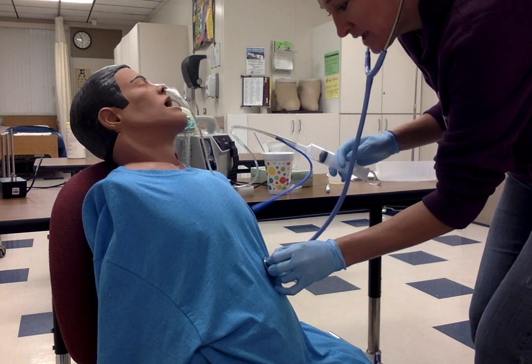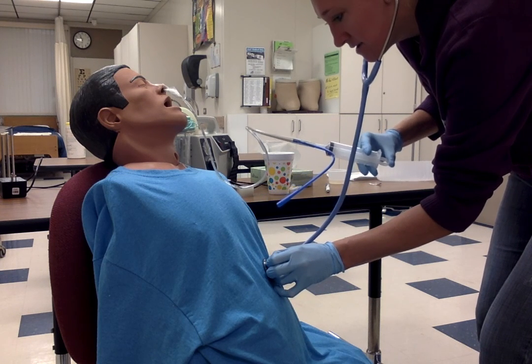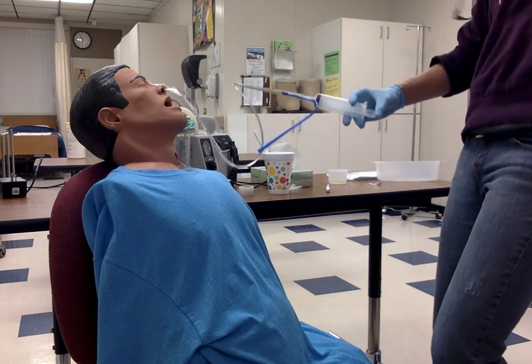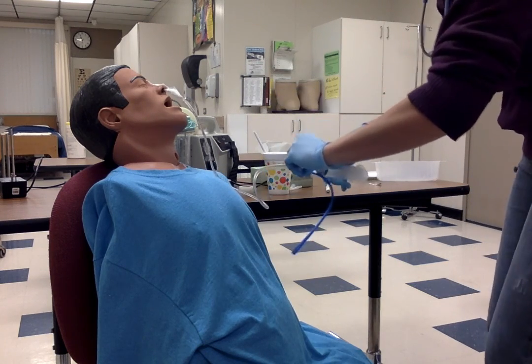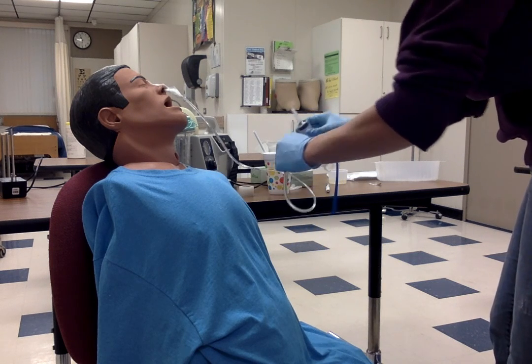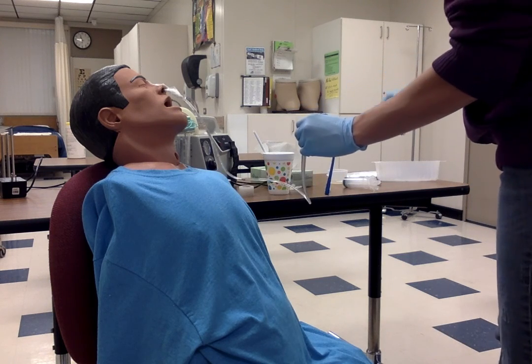All right, so down in the abdomen area, and I'm going to listen. Yep, and it was clearly heard. I could hear it really well. So now I know that this is in a good place at least. Of course, you're going to want to check placement with an x-ray. So we'll go into that in a little bit.